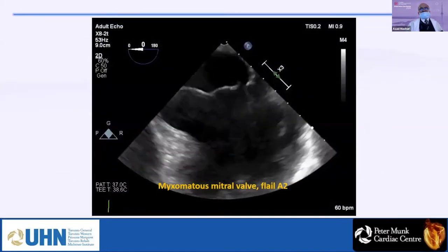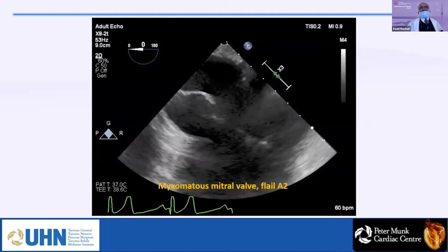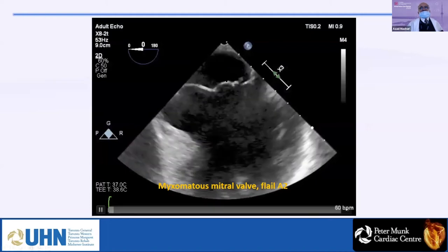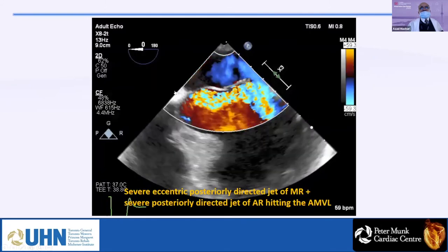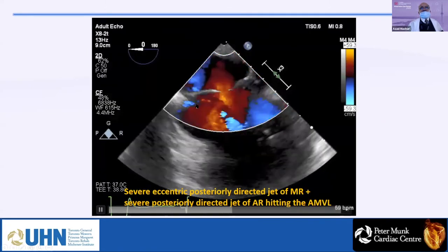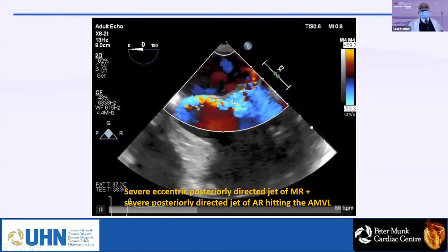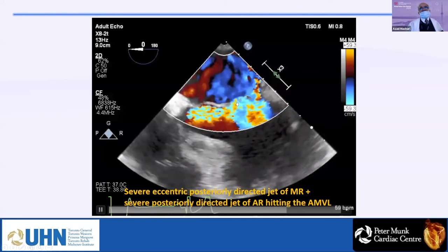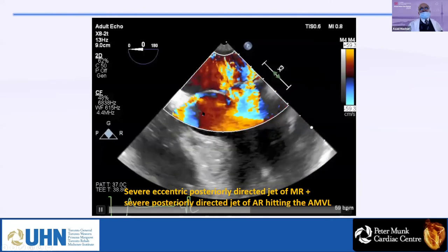In the first view, you can see the patient has a flail anterior mitral leaflet. With color, you see the severe MR, and at the same time the severe AR as well. So this patient has a double valve disease.